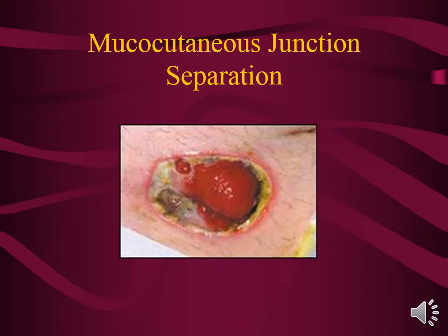And so to get this to heal, we would just be filling in the dead spaces, probably with some alginate, and then we would cover that up with some hydrocolloid, which is really, the funny thing is that how we discovered hydrocolloid is from the backing that is on ostomy pouches. So really we wouldn't have to cover it with hydrocolloid. We could just use the ostomy pouch itself to cover the alginate, the backing, and then that would heal up.